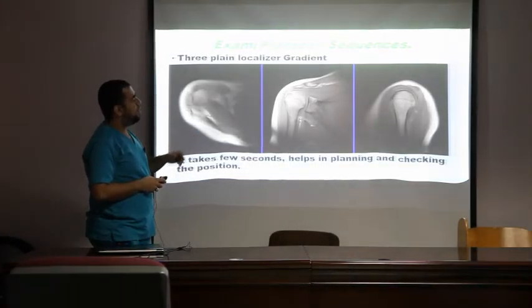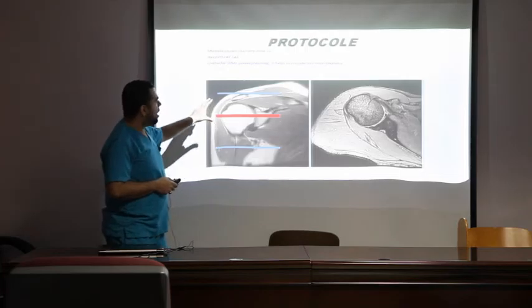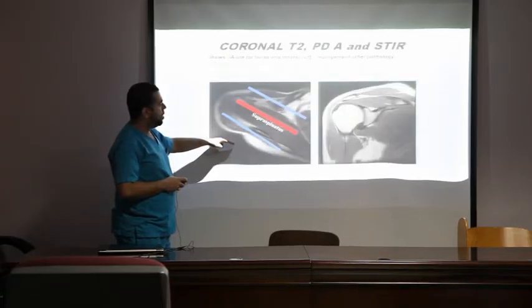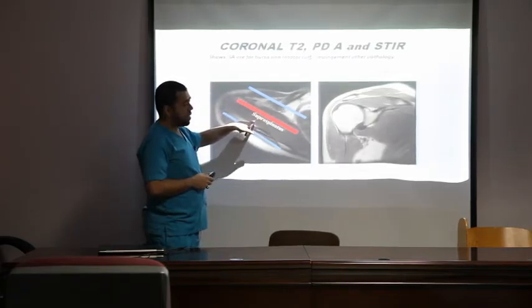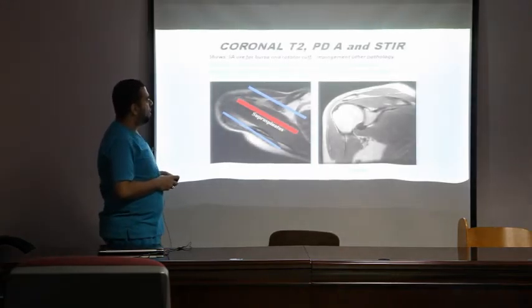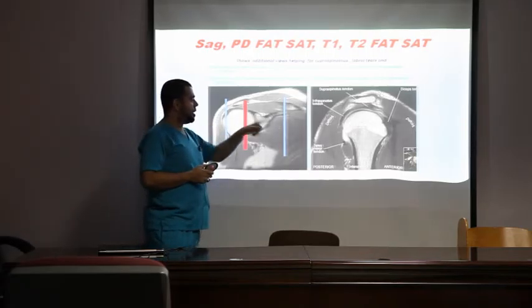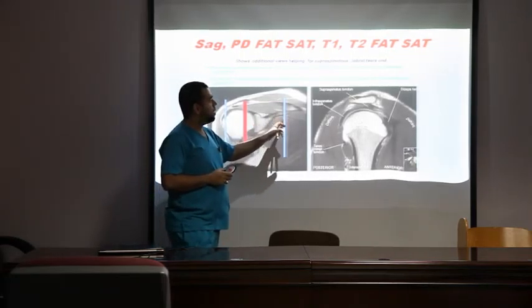We start with a three-plane localizer — a very short scan taking only a few seconds, giving axial, coronal, and sagittal views. To plan the axial, we use the coronal view, covering superiorly from the AC joint down to the axillary recess. For the coronal view, we use the axial view and align the slices parallel to the supraspinatus muscle, covering from the coracoid process anteriorly back to the infraspinatus muscle. Finally, we use the coronal view to plan the sagittal view, from the lateral border of the humerus to the subscapular muscle.